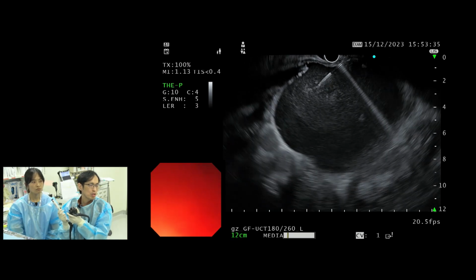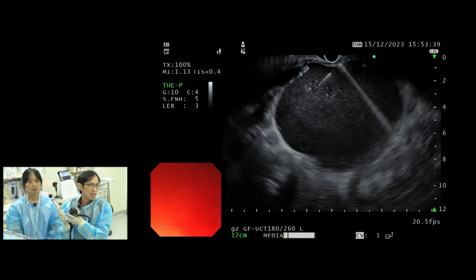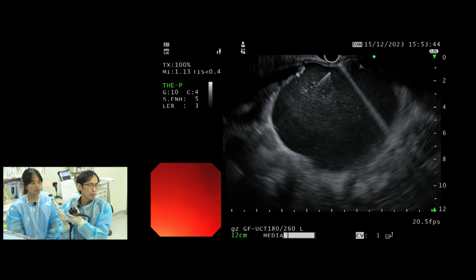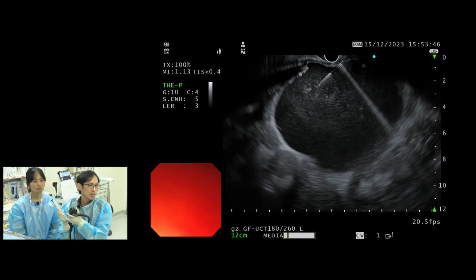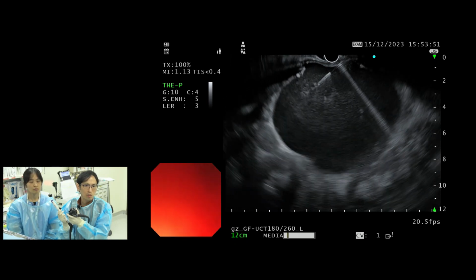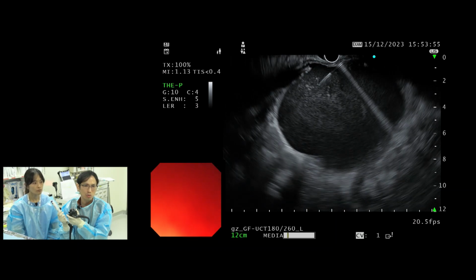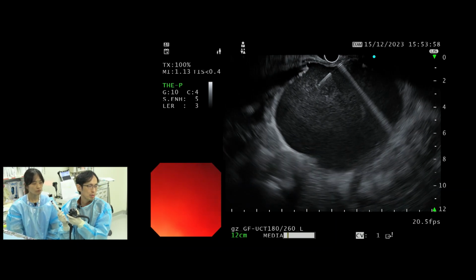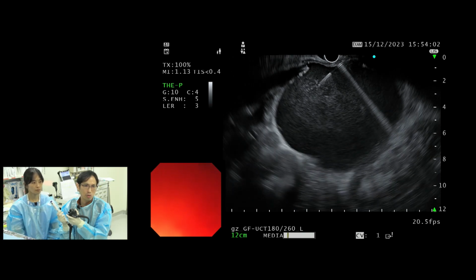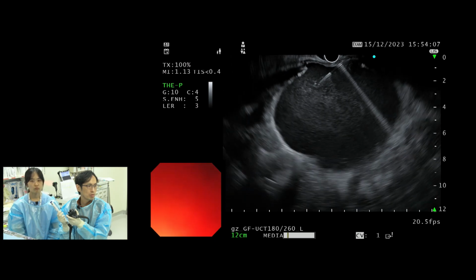But for a cyst that is maybe up to 2 to 3 centimeters in size with indeterminate morphology, I may do it. Of course, nowadays with good MRCP, if the cystic lesion clearly has ductal communication suggestive of BD-IPMN and no history of pancreatitis to suggest a pseudocyst, some of the doctors will comfortably call this suspected IPMN, or presumed IPMN. True.